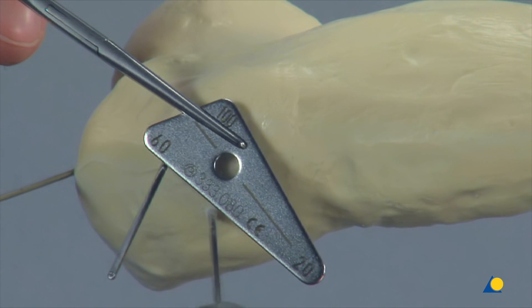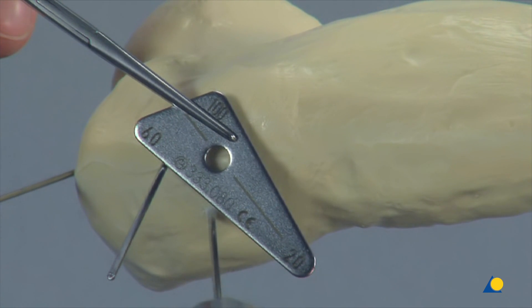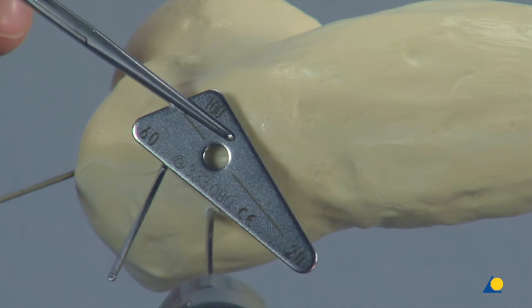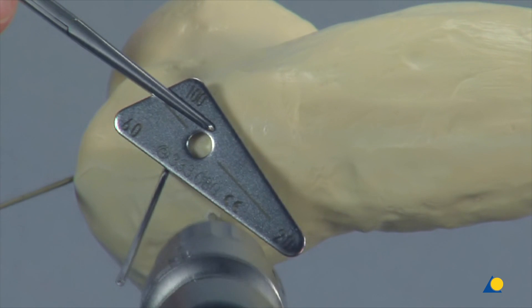A third K-wire is inserted parallel and posterior to the second K-wire at an angle of 20 degrees in the lateral view, while a triangular positioning plate is used to help align the K-wire at a 70 degree angle to the vertical axis of the shaft of the femur.